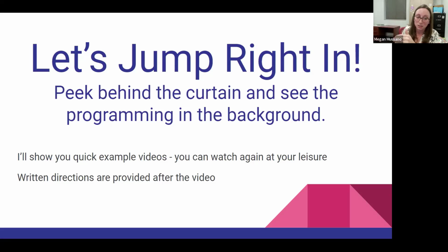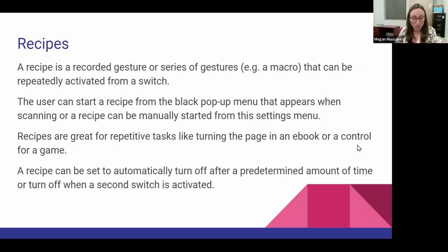Right afterward is another set of written directions. So you can watch the video to do the programming on your own, or you can just go back and follow the written directions. So just give them both a chance.